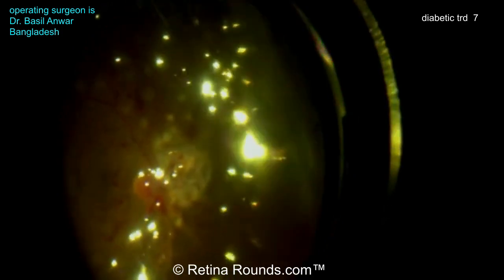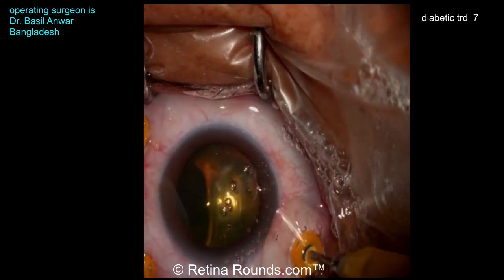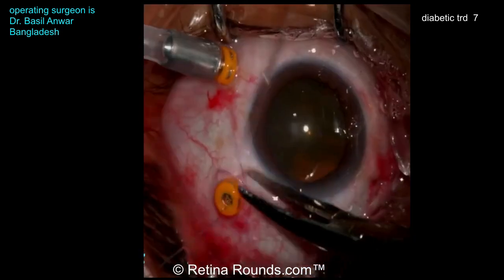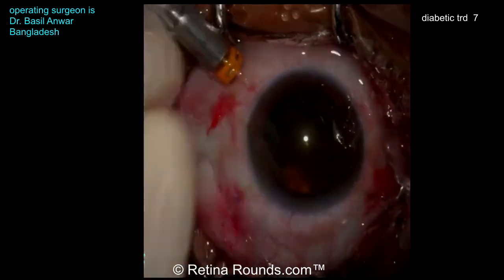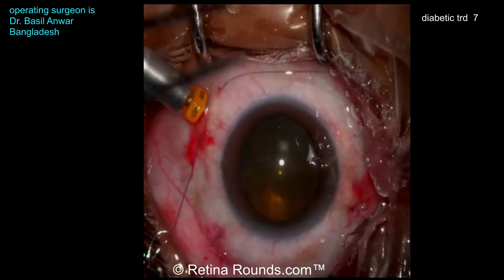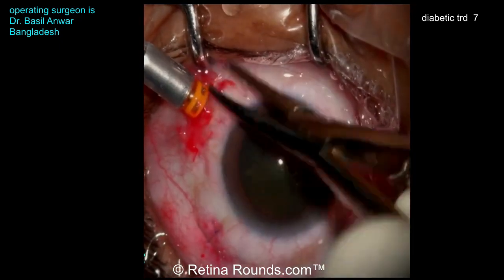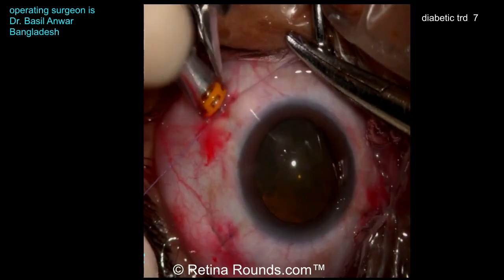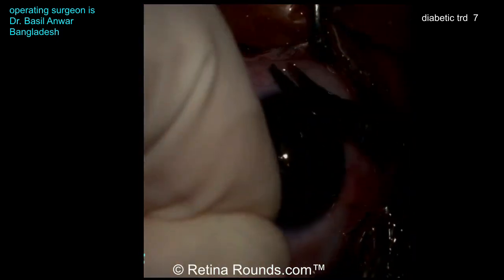Under air, I like to do more PRP anteriorly or even with scleral depression. It looks like he's choosing to use silicone oil here as a tamponade agent. Given that the break is more posterior, it would certainly be reasonable to use gas as well, especially given how well done the dissection was. Now he's sewing his sclerotomy shut — very important to do this when using oil, as subconjunctival oil can be really irritating and pro-inflammatory. He's doing a nice technique of placing an X-type suture, pre-placing it before removing the trocar so that he can immediately close the sclerotomy and not lose any oil.